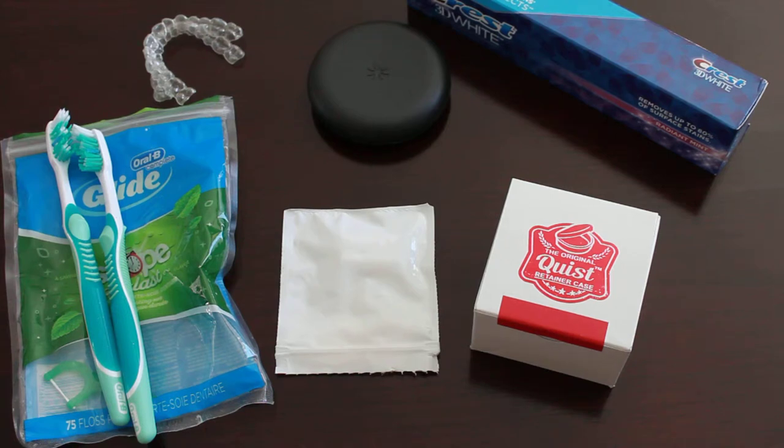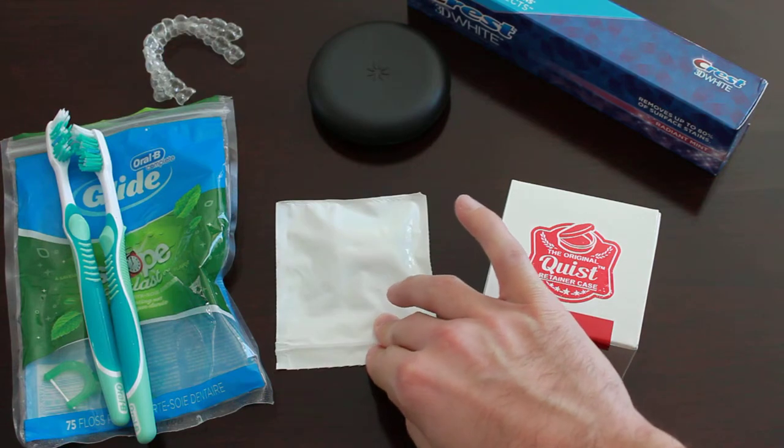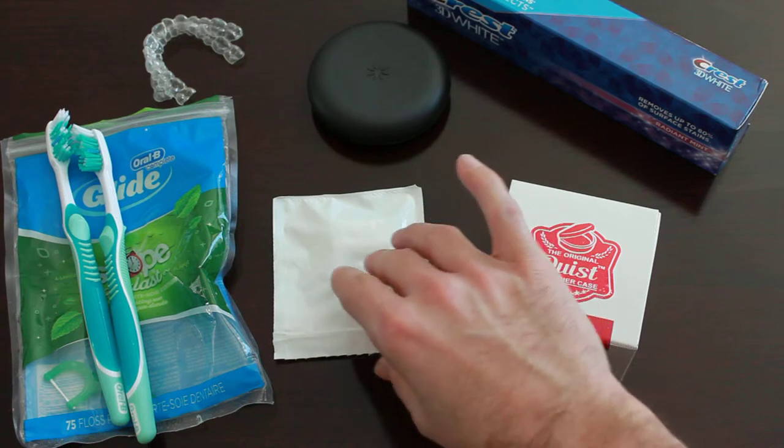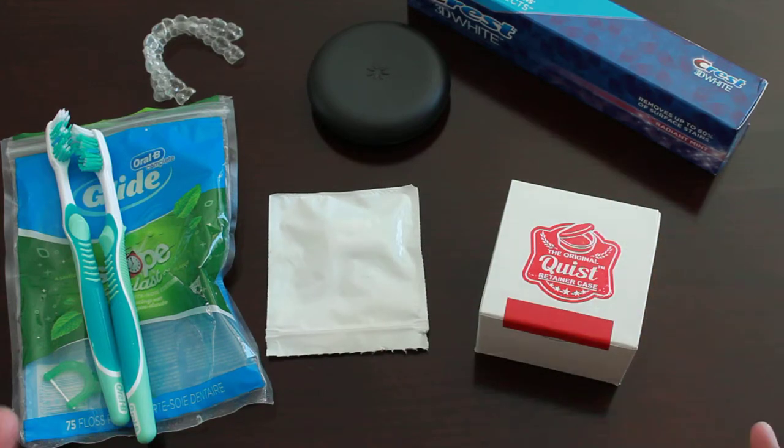Hey guys, welcome back. Sorry it's been a while — we had a winter break and it's just been really busy. But I really wanted to get a video together to go over Invisalign and the basics of the items I use pretty much day to day. I did get something today in the mail which I wanted to show you, and another accessory that in the beginning I think is a must, but as you go through the process you really won't need it. None of this stuff is expensive.